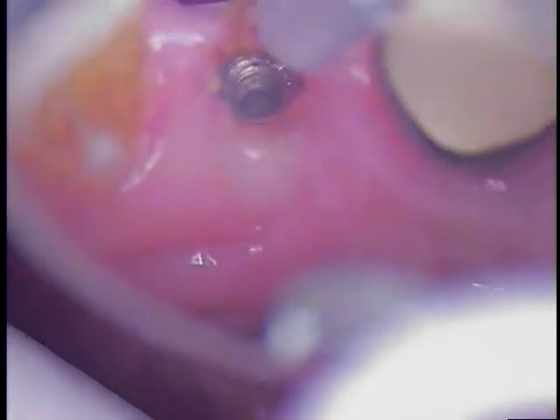Again, we'll just rinse that now. Once again, absolutely no bleeding because we used a laser. Okay, we'll make one more pass now, one more cleaning pass. Just use microbrushes. I now dip. I used to use the technique where we used a syringe. I don't do that anymore. Only if it's real super small. Now I've learned just to take a brush and dip it.